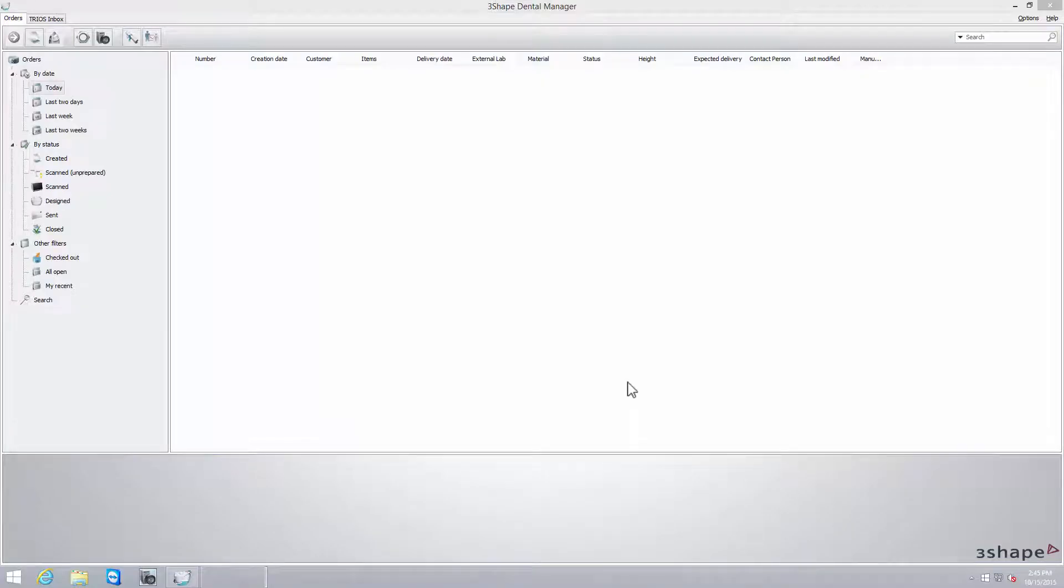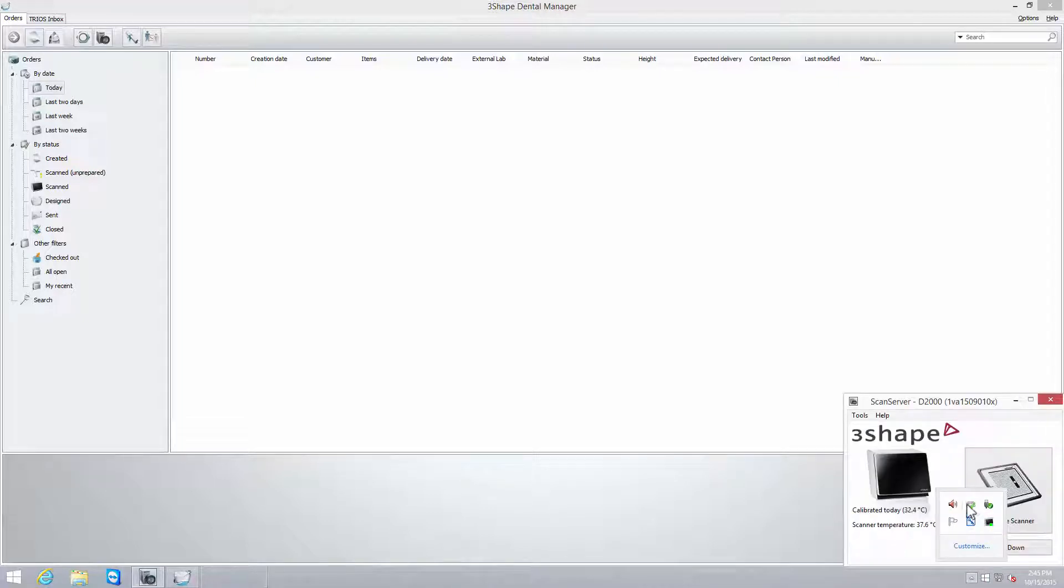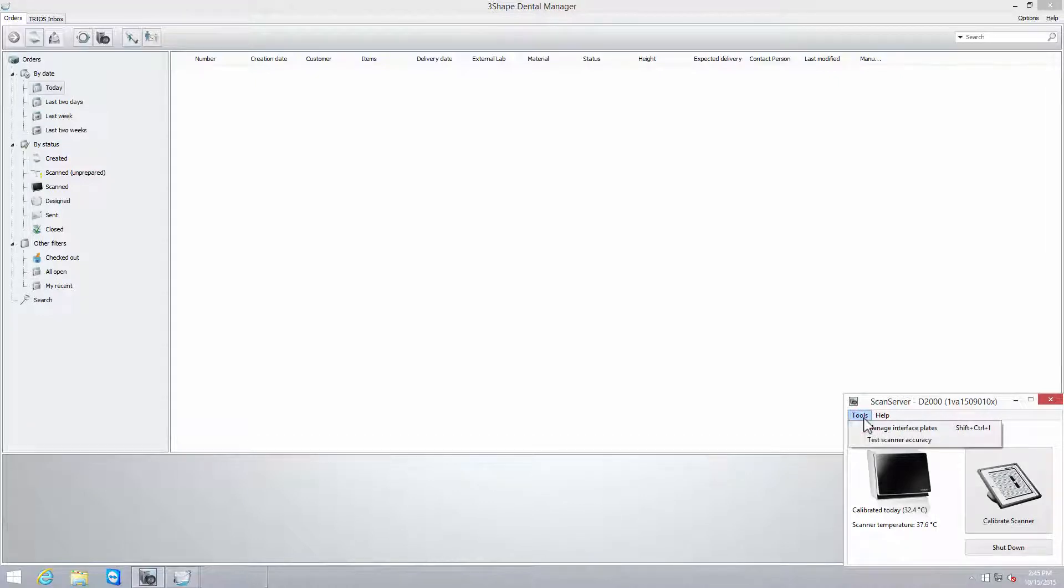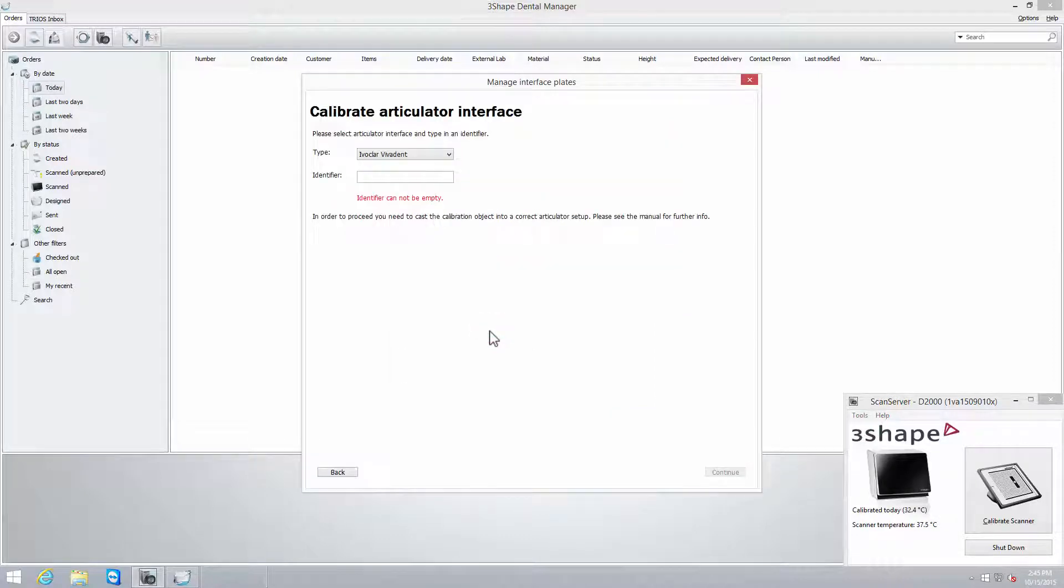Now, when the calibration object has been mounted in the articulator, you can launch your ScanSuite application. In the Tools tab, open Manage Interface Plates and click Add button. The Calibrate Articulator Interface window will open.